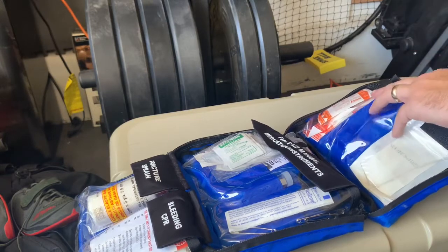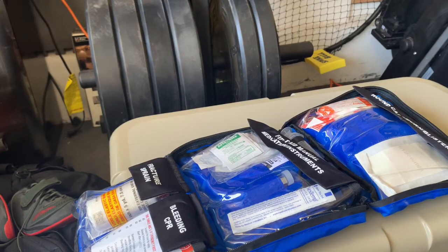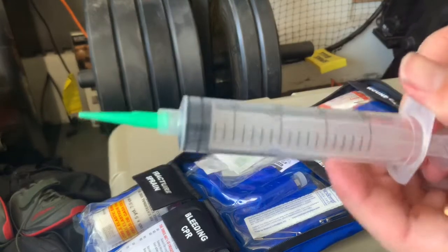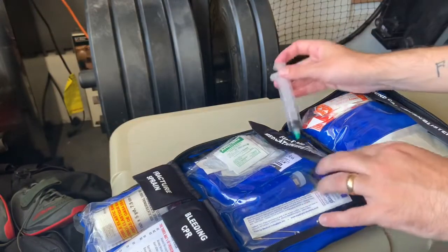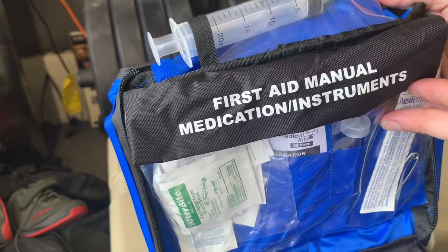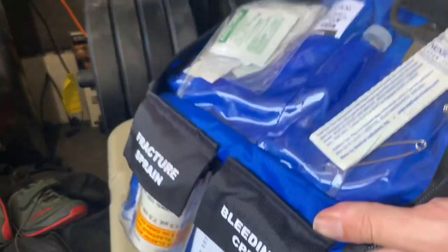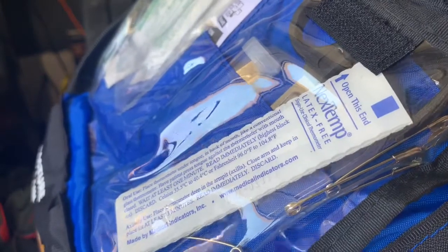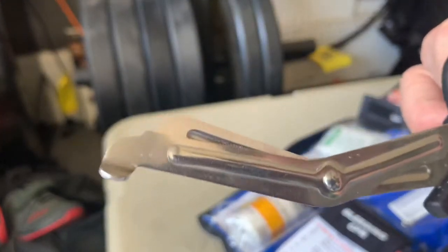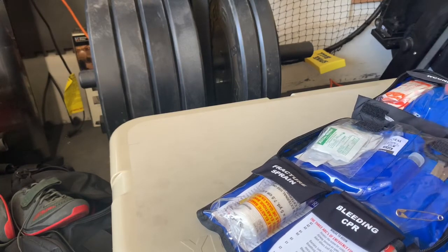My trauma kit has quick-clot bandages specifically, but for a standard outdoors kit I didn't feel that was entirely necessary. Moving to the next pouch — medications and instruments. We pop that open and inside we've got safety pins and a small pair of trauma shears. I have a bigger pair in my trauma kit, but shears are very important and helpful in both kits.